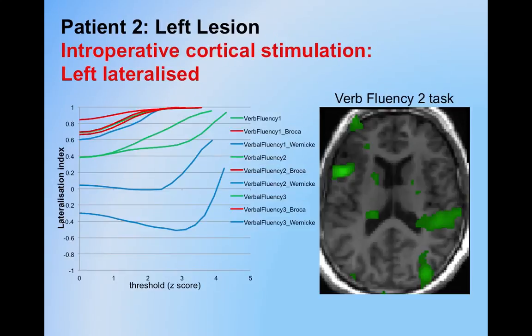So this patient had, do you remember in that little movie I showed you before where they were using electrodes to zap the brain and they would see the patient move their hand? So they actually did this during this surgery. So again, that's an ultimate validation that we're sure that they're left lateralized. They were zapping the part of their brain that wasn't moving their hand that was controlling their language, and they got the patient to do some language tasks or try and speak whilst they were doing it, and they found that as they put the electrode onto the language part of their brain, they were unable to talk or unable to listen properly. So again, we have this ultimate validation.